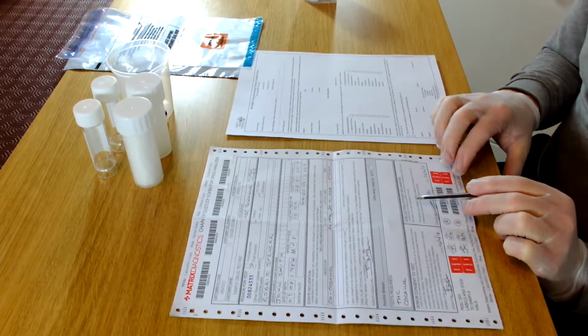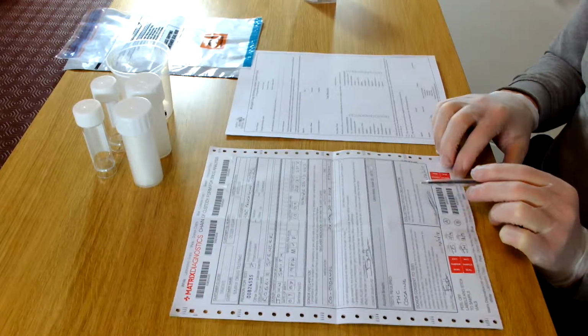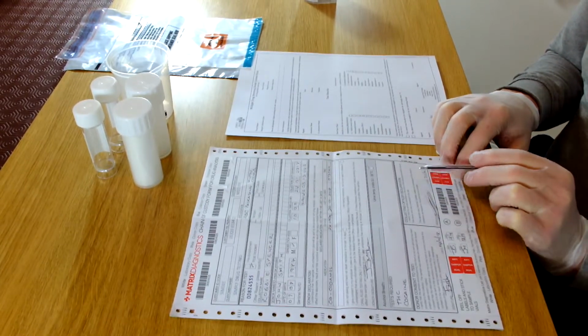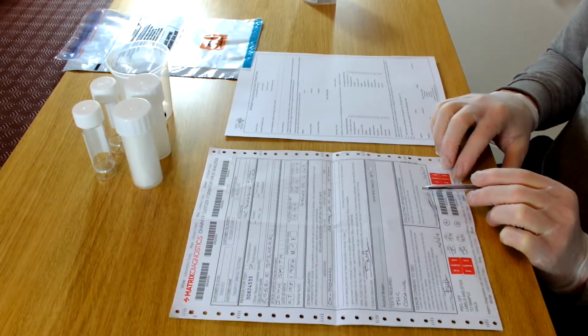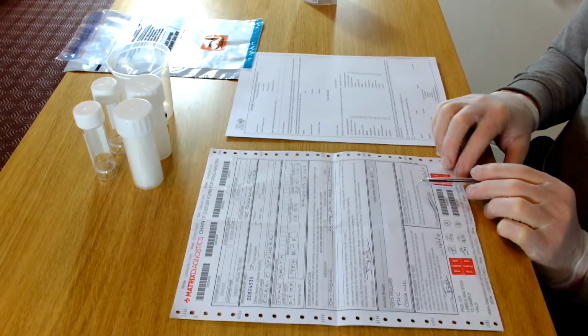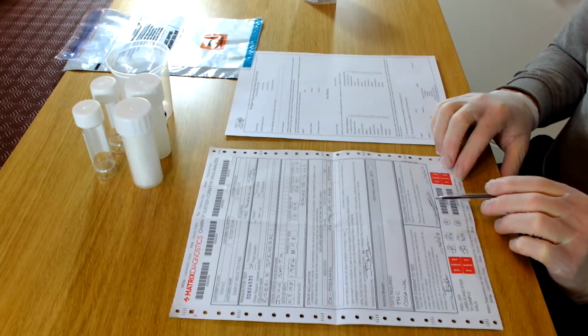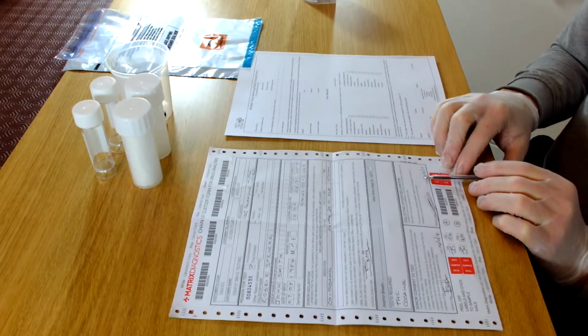And then there's a collecting officer declaration which says I certify that the sample identified in this form is the sample provided to me by the donor who has consented to the test. The sample was collected, labelled, sealed and packaged in the donor's presence as required by the instructions provided. The collecting officer then signs and dates in there.